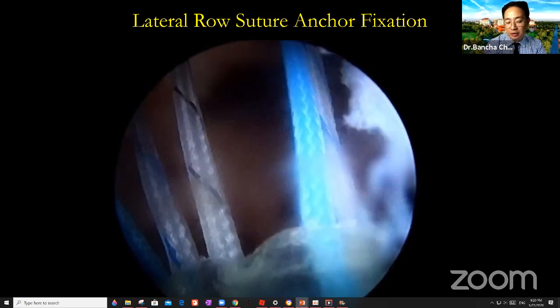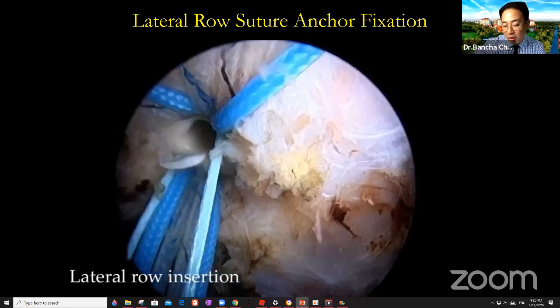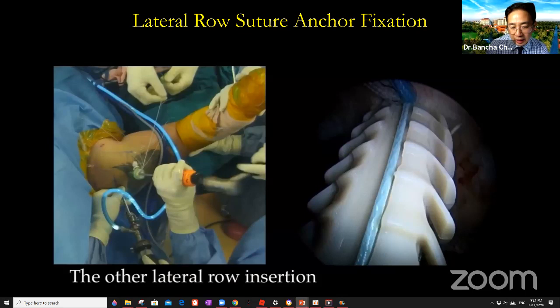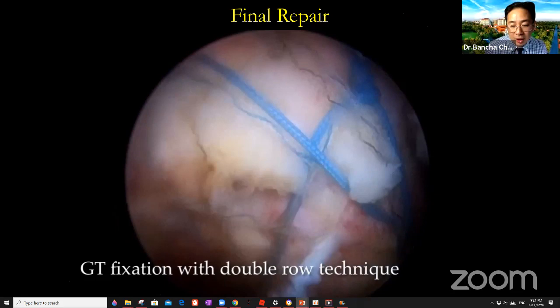I want to spread this lateral row as far as possible. This is a posterior one, so I put it very close to the infraspinatus insertion, close to the posterior cortex. And internal rotation. The benefit of this beach-chair position is that when you put the lateral anchor, you can internally and externally rotate, so this lateral row can be put as far as possible. Here I find good bone, and you see the external rotation? I put the anterior one. So in one hole, we have six sutures, totally 12. The good thing about having many sutures is that you have a wider area of suture and pressure distribution, because you need pressure to push on this piece of bone for better healing. That's my idea.